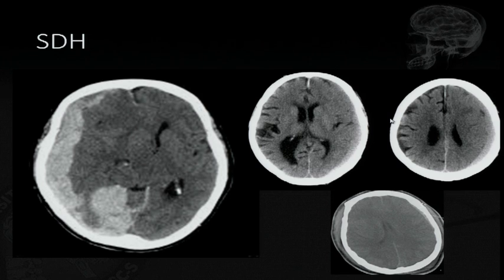And again, I know you're pushed to do the read in the control booth in the CT, and that's fine, okay? That's not a problem. You do your best, you say it's clear, and they can start mixing the TPA. You go back and you read it, and you find something, just call them, and they can turn it off, and maybe nothing happens.